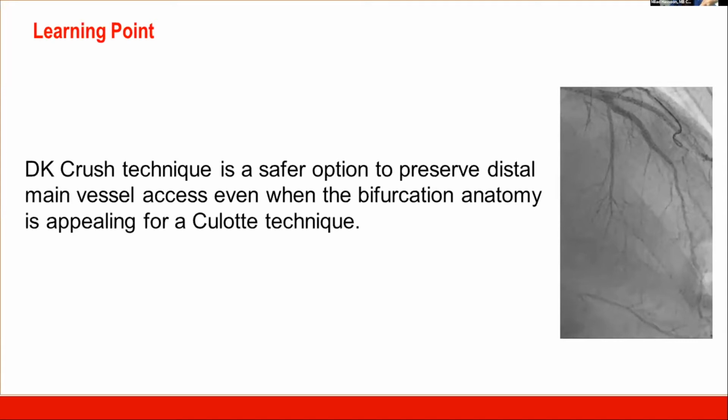And I'm just highlighting that sometimes as an operator, you'll be forced to take some pragmatic decisions and get the intervention to progress. Yeah, certainly, even outside of aneurysmal segments, simply bifurcations with very challenging takeoffs that cannot be wired in standard ways, sometimes taking the risk of ballooning across the bifurcation to modify the plaque and the channels can be favorable for the operator.